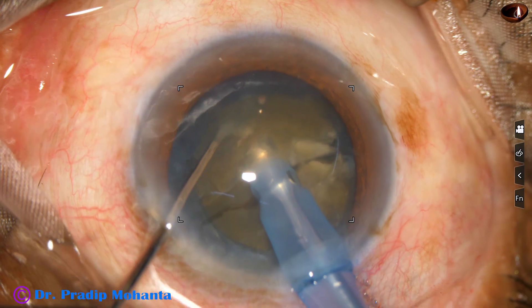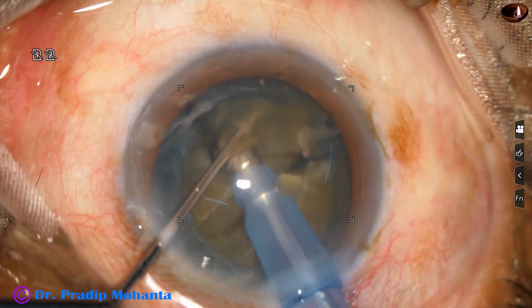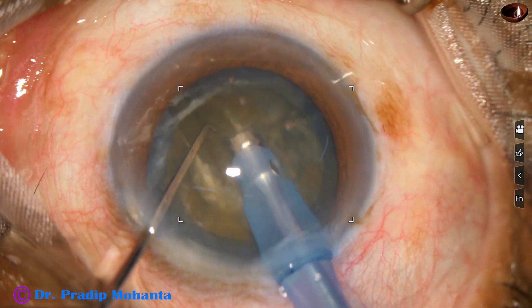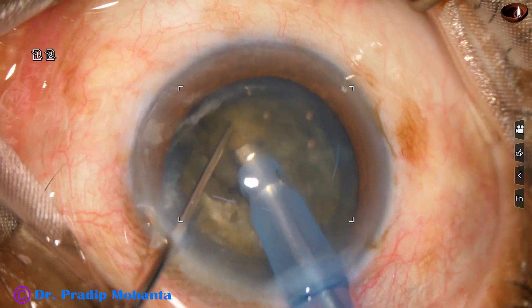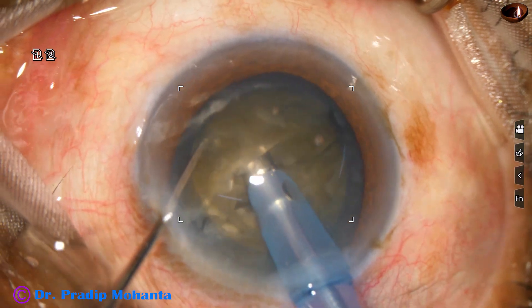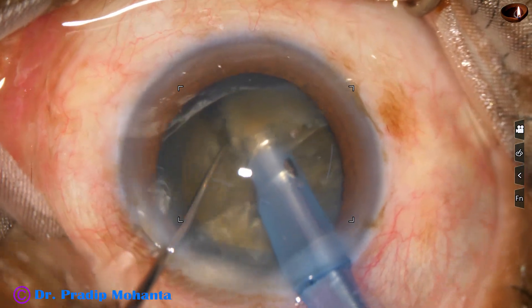The nucleus has been rotated 90 degrees in this case, and I have got a free nuclear fragment. This is the other piece of the hemi-nucleus. And now I come to the other hemi-nucleus and chop it into two pieces.